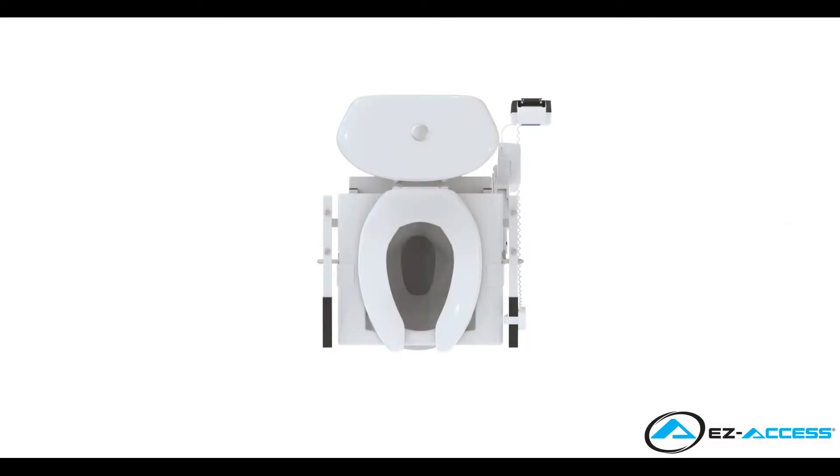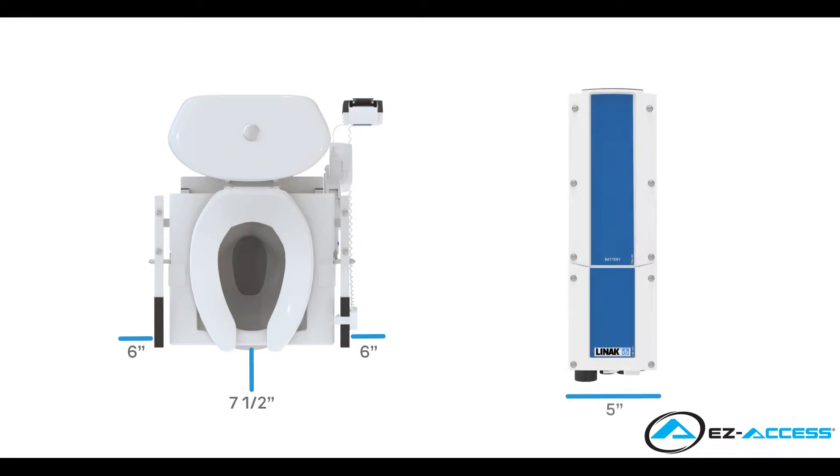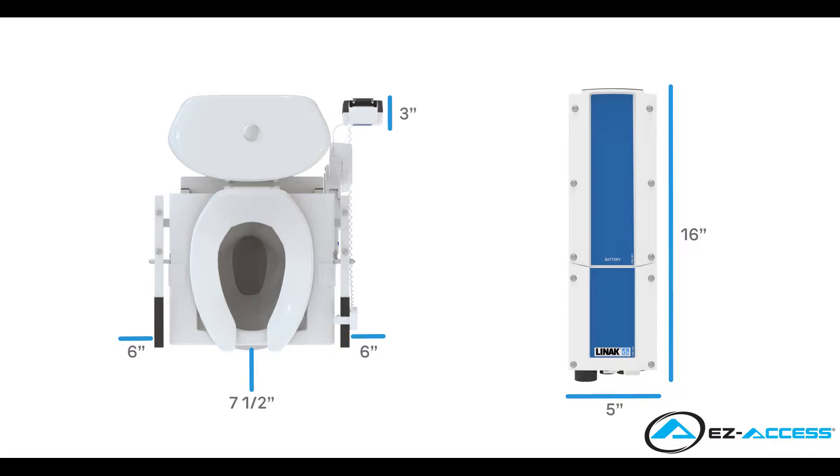Before installation, ensure there is sufficient space around the tilt for proper operation. The tilt frame requires 6 inches on either side of the toilet bowl and 7 and a half inches in front of the bowl. The battery and control box requires 5 inches by 16 inches of wall space for mounting and protrudes 3 inches out from the wall.